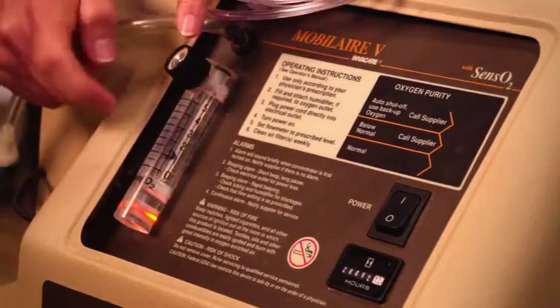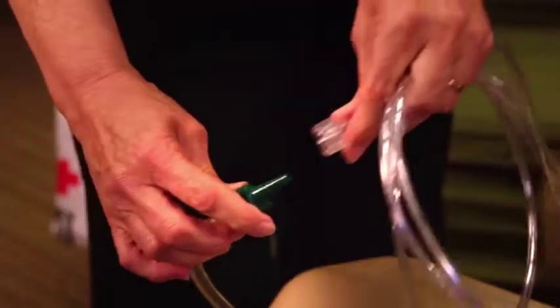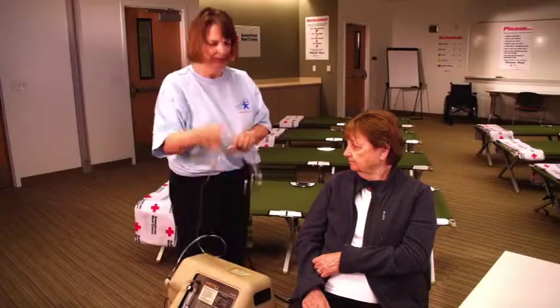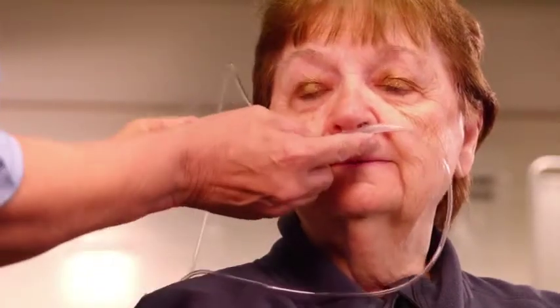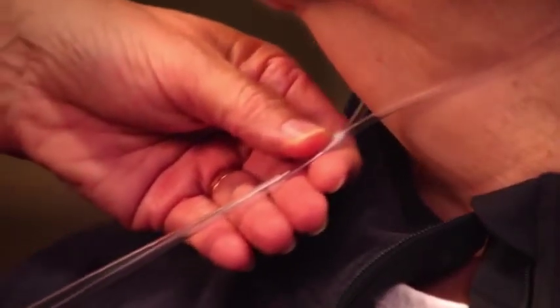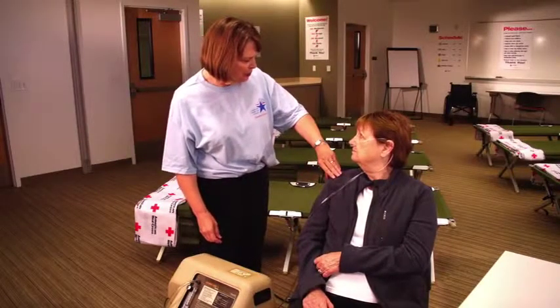Adjust the regulator to the prescribed airflow. Attach the tubing and nasal cannula to the machine. Check for airflow. Place the nasal cannula in the individual's nostrils, loop the tubing over their ears and tighten under the chin. Have the individual use the concentrator for the prescribed amount of time.